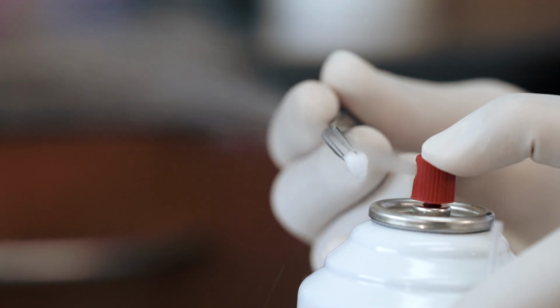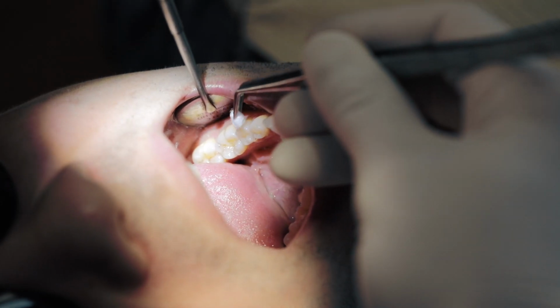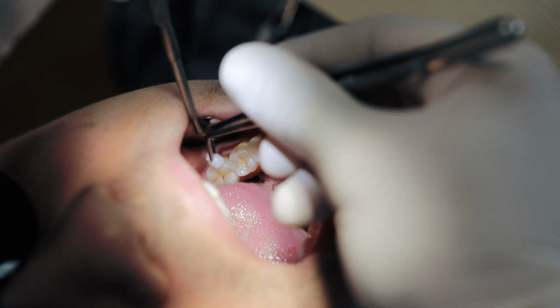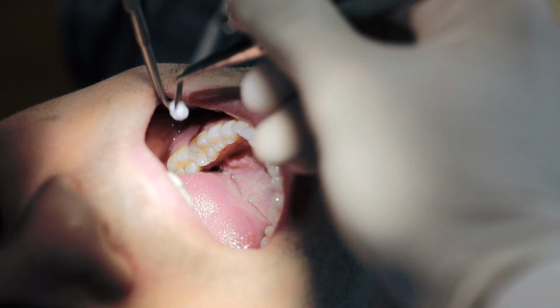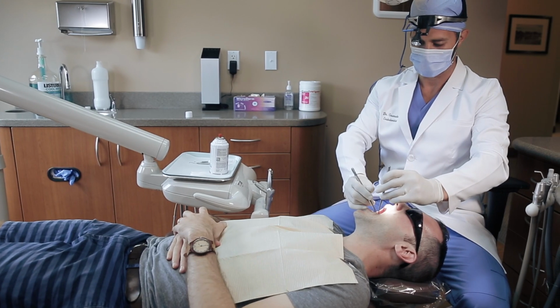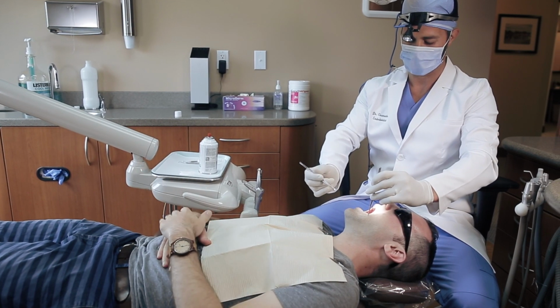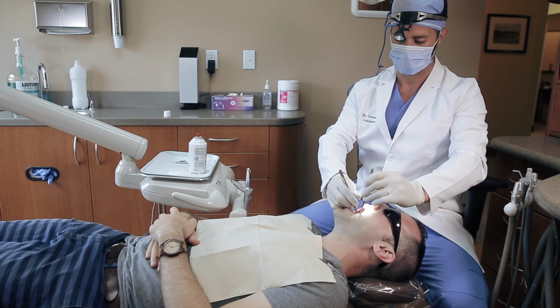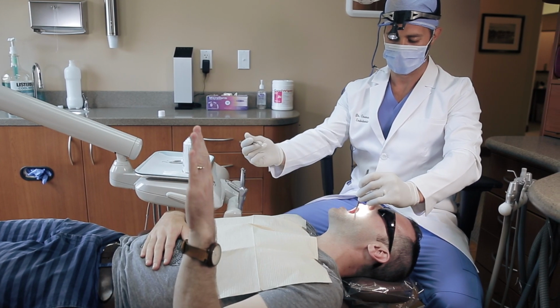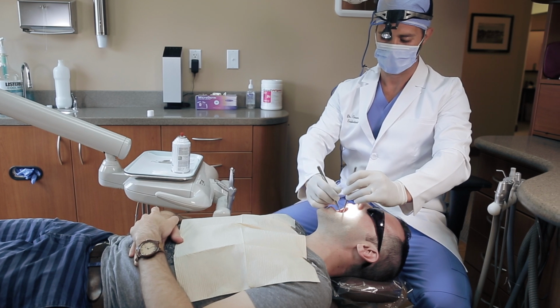Spray the cotton pellet that is being held by your cotton pliers and test the mesial tooth, then the distal tooth, and finally the suspected problem tooth. Remember, you're just trying to relate the problem tooth to the baseline responses from adjacent teeth. Cold testing the suspected problem tooth last is super important for time efficiency because if you're dealing with lingering cold pain, they could be raising their hand for minutes, and that's going to slow down the exam process.